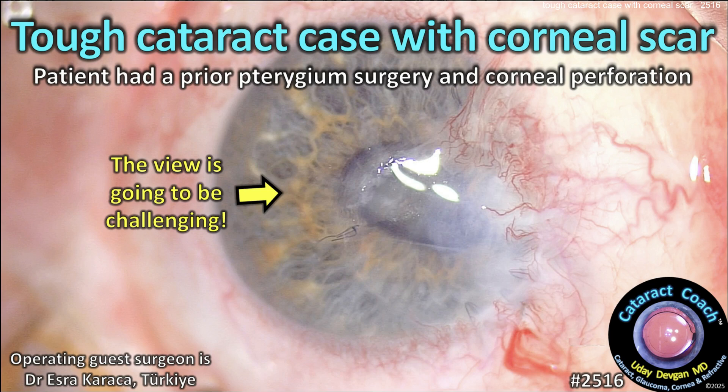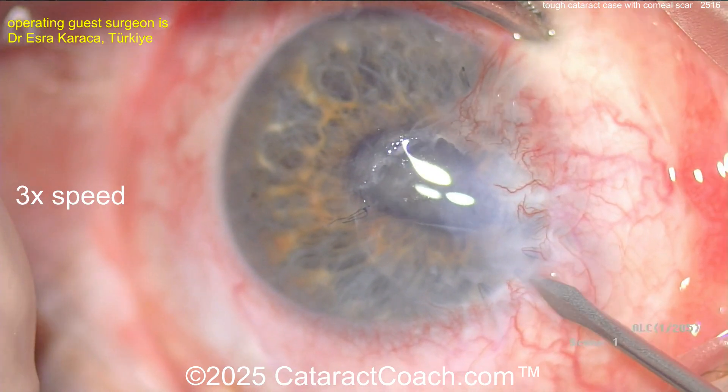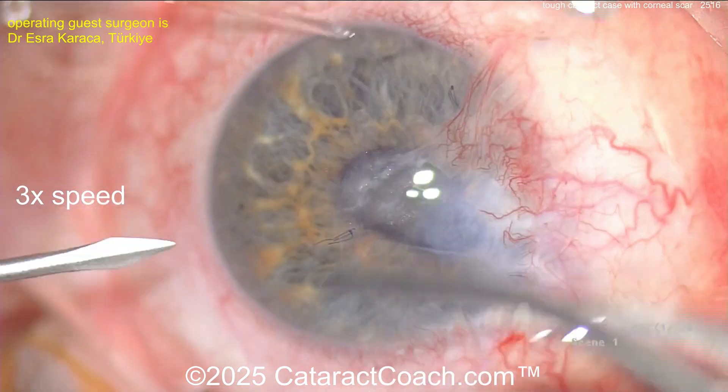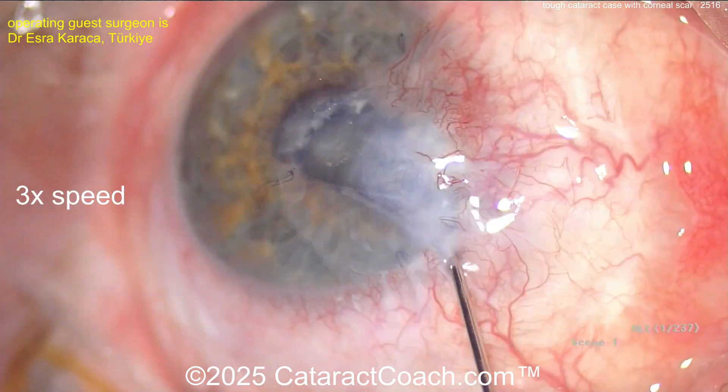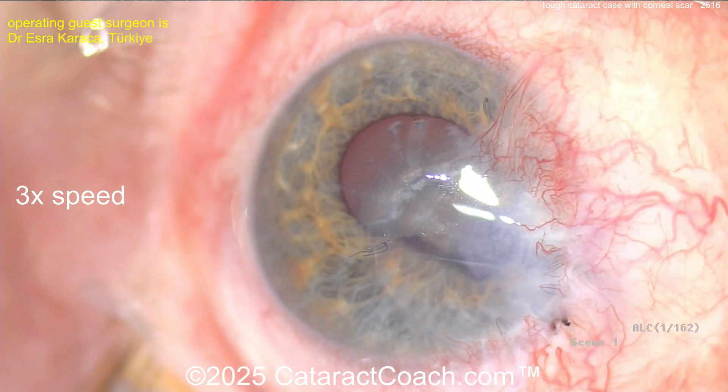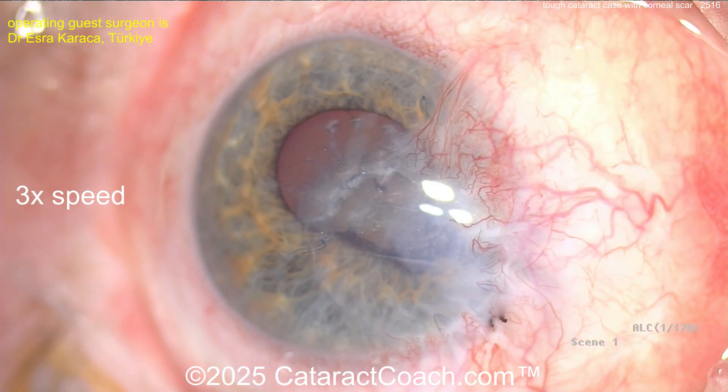A tough cataract case with a corneal scar at cataractcoach.com. This patient had a prior pterygium surgery which ended up with a corneal perforation. You can see there's a big scar over the eye, and there was a perforation — you can see the corectopia, the shifting of the pupil.